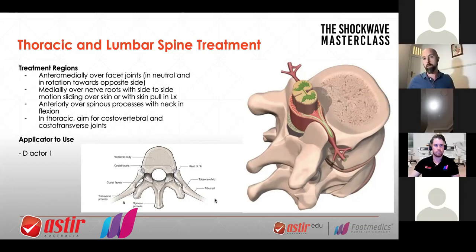You're always applying it from the back. In the thoracic lumbar, you could do a lumbar anterior approach, but you won't do that in the neck — it's unnecessary. Generally, I would only ever apply it from the back towards the side of restriction. You don't want to mess about with new angles that aren't generally used by clinicians, particularly when it gets too close to arteries. I apply it through the SCM quite often, but I'm not going through the carotid artery. I think that's logical.